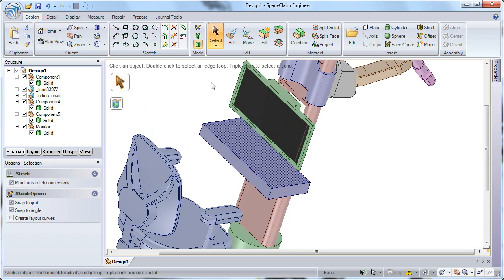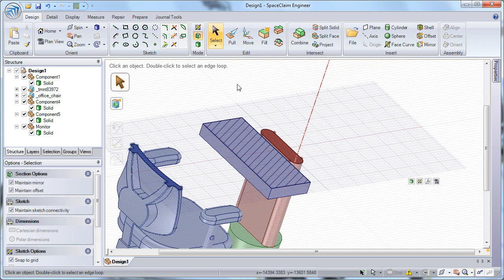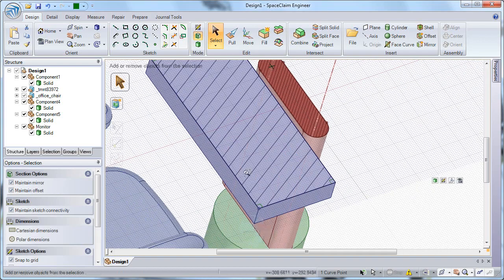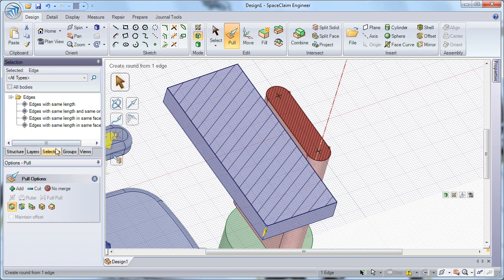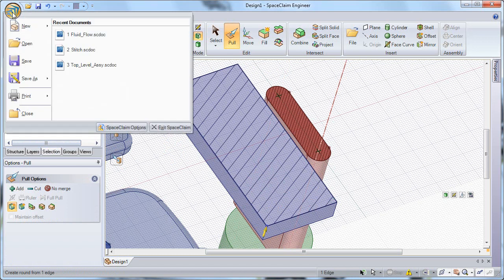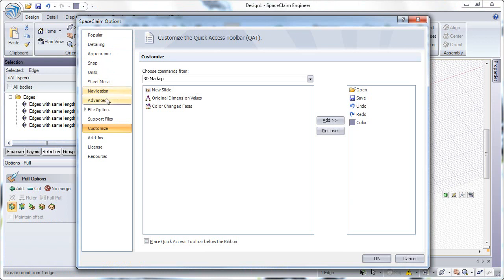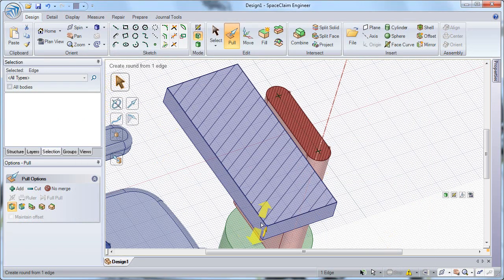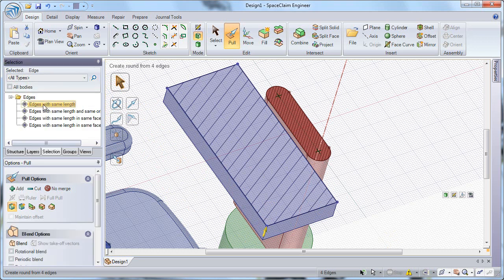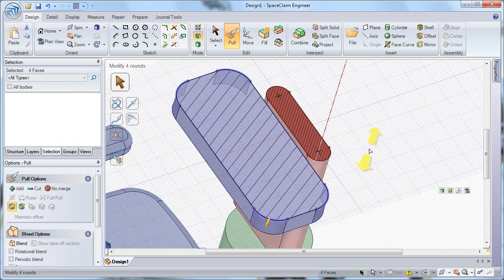So let me select on the top face and go to section mode to get a 2D cross-section view of that table. And I can make edits in 2D cross-section mode just as easily as 3D. So I want to round off all four of these corners. So let me go ahead and select on one of my corners using the Pull tool, and then go to my Selection tab in my structure tree. You notice that it automatically finds similar geometry because of the option that I had set up earlier. If I go to the Options menu under Advanced, this option, automatically calculate power selection, will allow me to automatically calculate results when I click on geometry. So using the Selection tab, I can select all edges of similar length, and be able to pull to round those edges simultaneously.